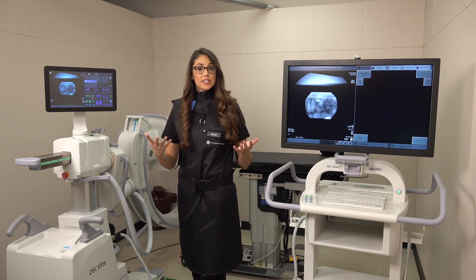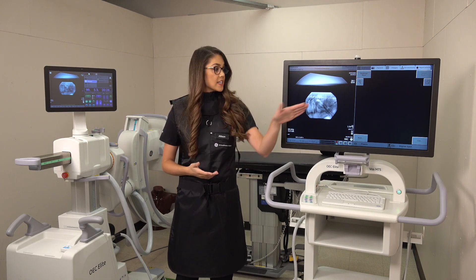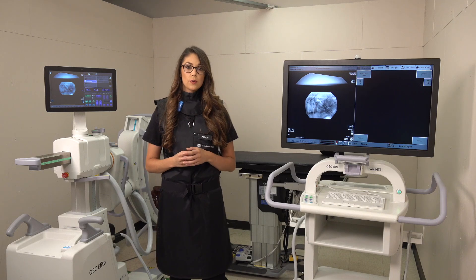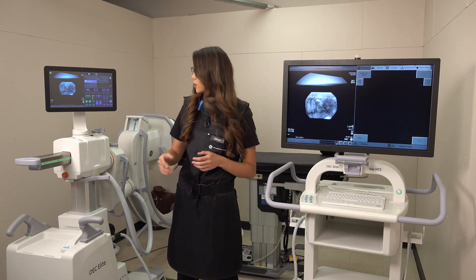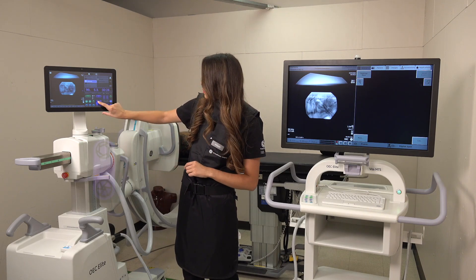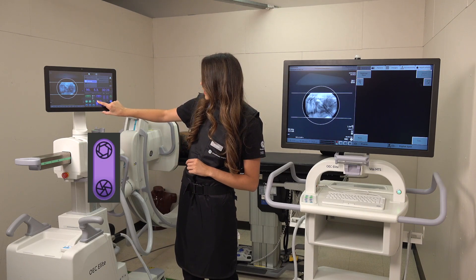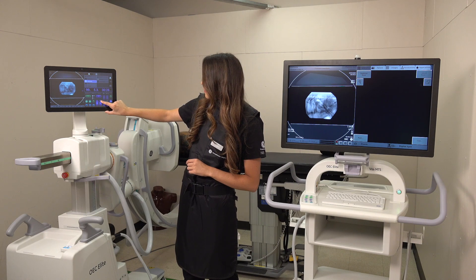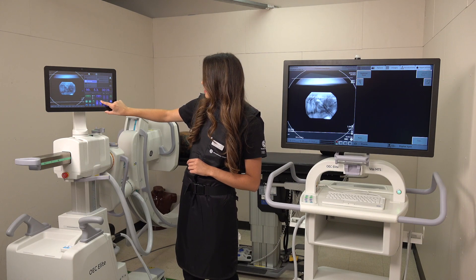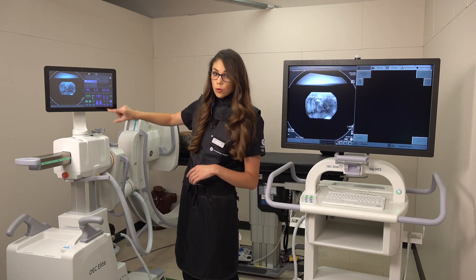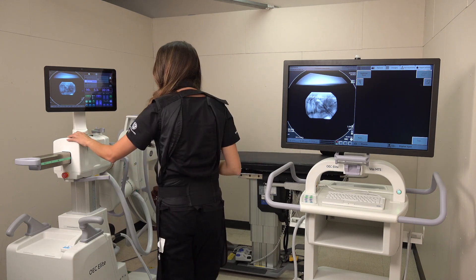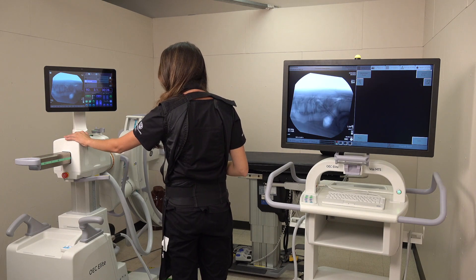Now let's say you wanted to see the entirety of the field of view. You would remove your collimators by holding down, and then of course take a new picture to showcase your entire field.